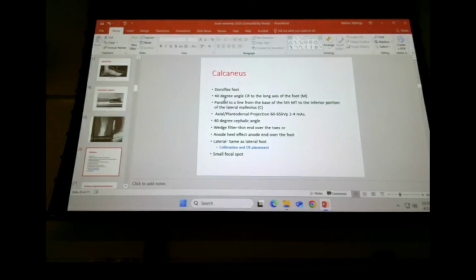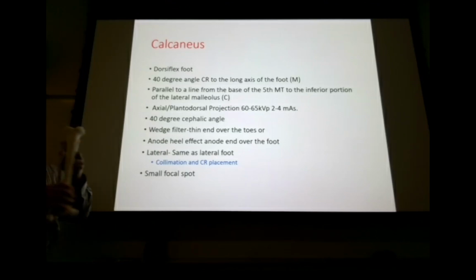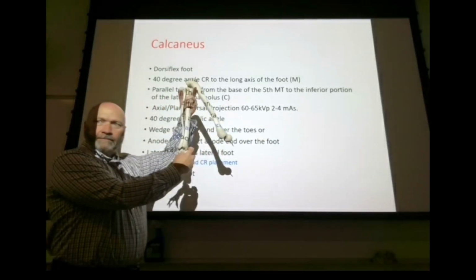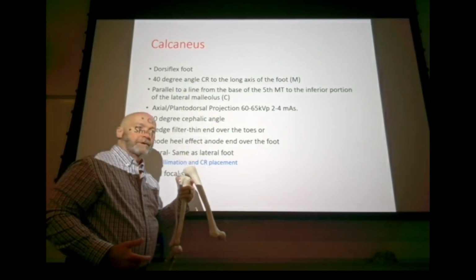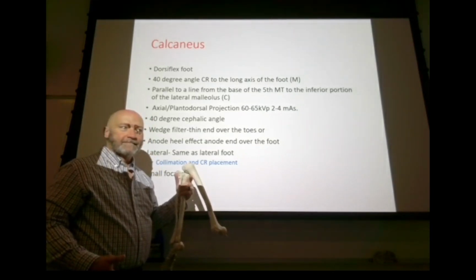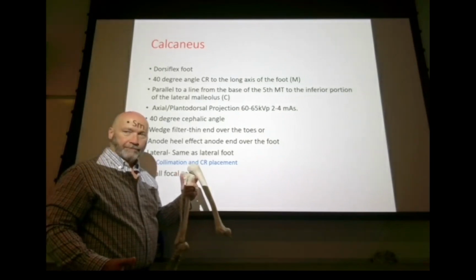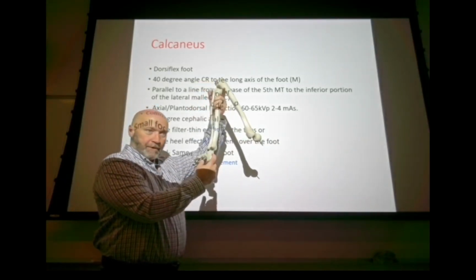All right, so calcaneus. The key to imaging a calcaneus and determining whether or not the patient has a fracture of the calcaneus is whether or not they can perform what you need them to perform. What I mean by that is your Achilles tendon hooks in right there. That's where your Achilles goes. So when you dorsiflex your own foot, let's say you're trying to stretch out your calf muscles, what do you feel? Straighten your leg out and dorsiflex your foot. You feel that stretch? That's in part because that is being pulled upon.